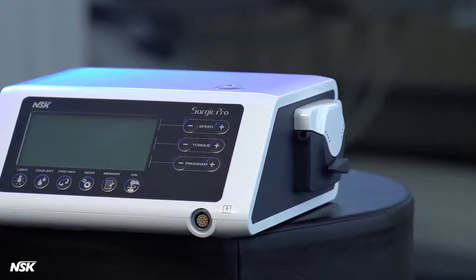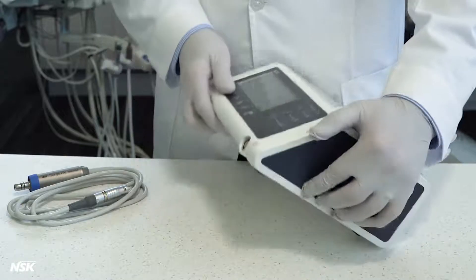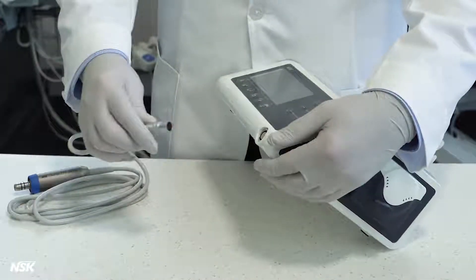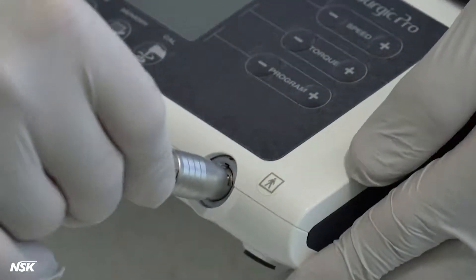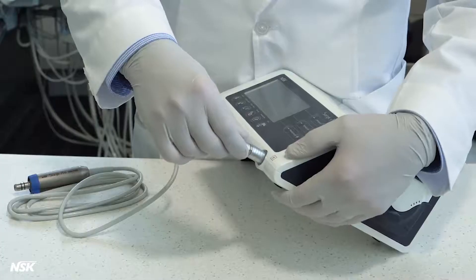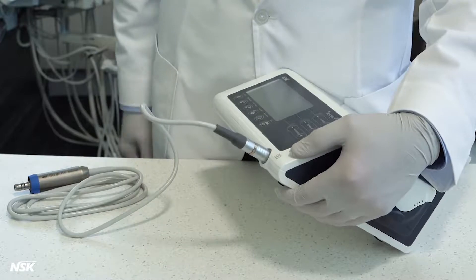Now let's move on to setting up your Surgic Pro. Connect the motor cord by aligning the marks on the cord connector and the connection on the control unit. Push in the connector until you hear a click, then slightly pull the cord to make sure it's locked in place.